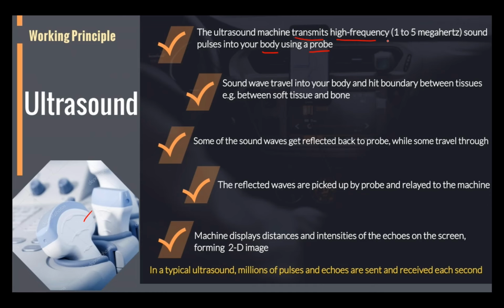For example, if you want to image the kidney, you place the transducer on the kidney. If you are a service engineer and go to a hospital, you will see the ultrasound has a screen. It will give how much intensity of sound needs to be transmitted, 2 megahertz, 3 megahertz, we can choose, and how much duration, for example 2 minutes, 3 minutes. Once they turn on the machine, it will start sending signals and receiving signals. It keeps transmitting and keeps receiving.